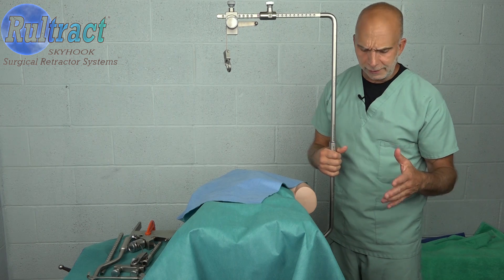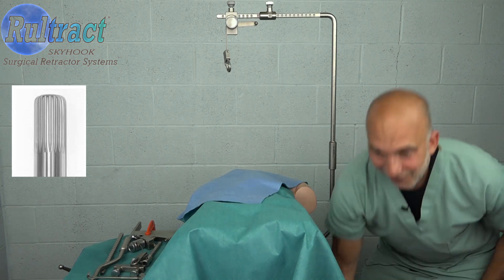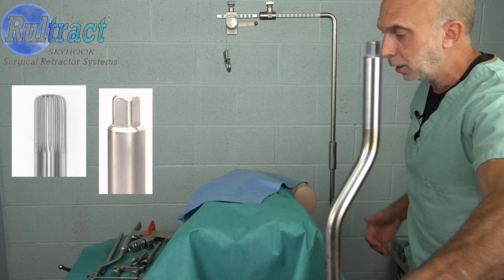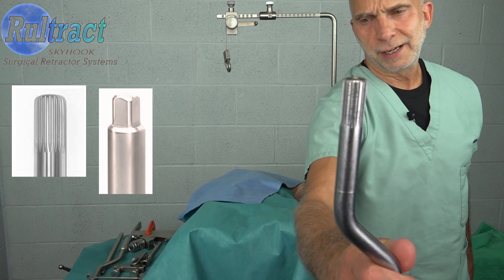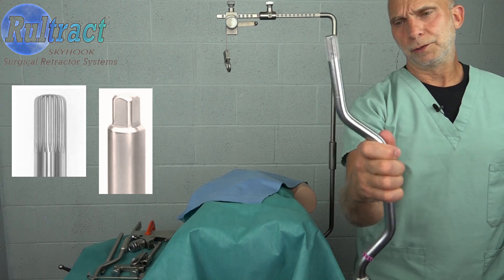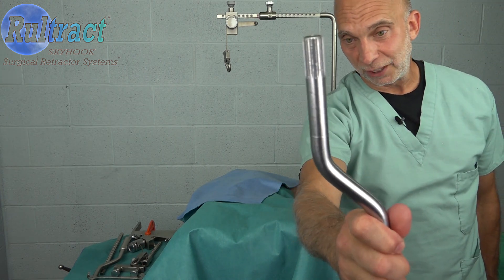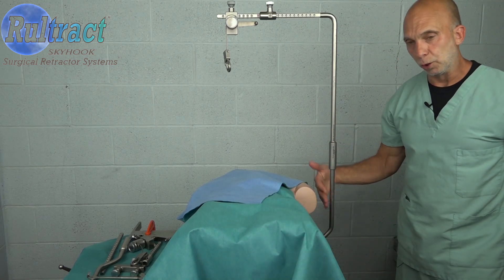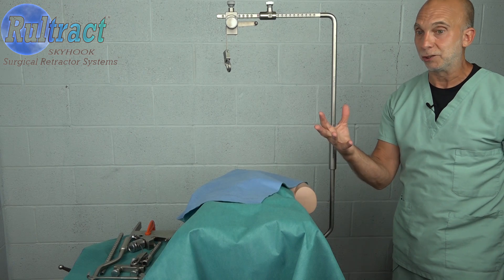The problem is these are spline connectors and your retractors that you have in house are square tip. You can see here that's a square tip that connects to a square post and post clamp. The new larger patient population has a spline connection, so you can't mix these two. The new ones do have a spline tip; your old ones have a square tip, so you're going to need to purchase the lowers as well as the uppers. You can purchase them for all of your trays or you can just purchase one set and set up a Rural Tract large patient tray.